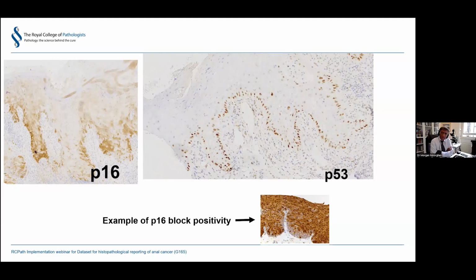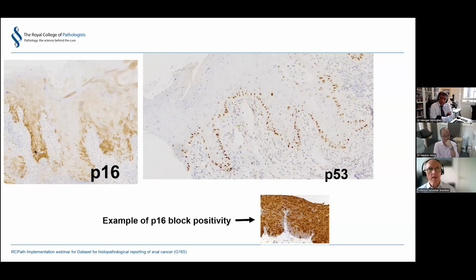If you've got something which looks like lichen planus, but it's hypertrophic lichen planus, then, and this is purely personal opinion now, you would look again, because hypertrophic lichen planus, which has a lot of hyperkeratosis and parakeratosis, doesn't typically occur in the anal canal. It's a lower limb lesion. And then you would lower your threshold when you're trying to assess for atypia.